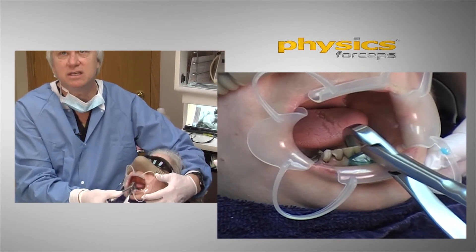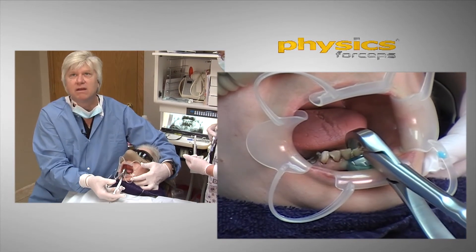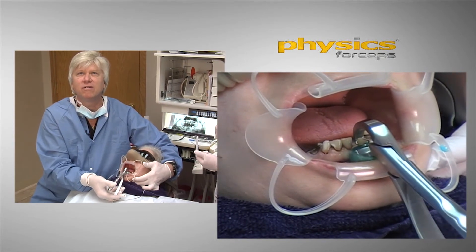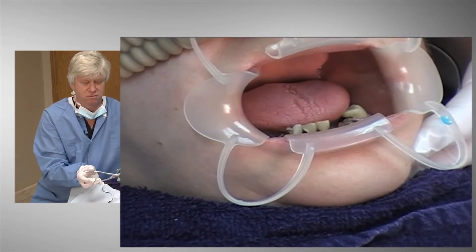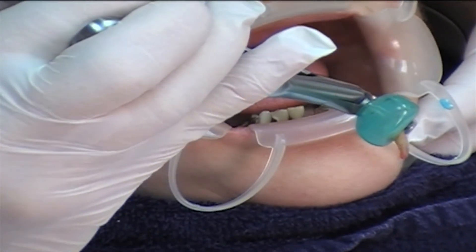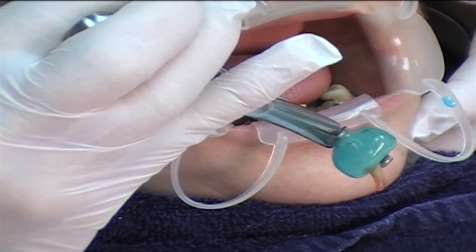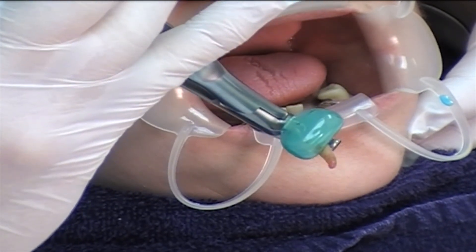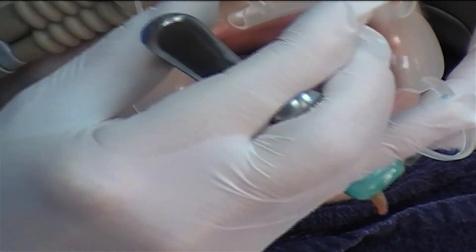Now I felt the tooth — you can see it's starting to move a little bit. It's coming. And that tooth just elevated right out of the socket. Now granted, this is an anterior tooth — but it is a big deal. There's not a lot of tooth structure there in some of these teeth, and you can see there was no physical force at all with my hands or my arms. It really is magic — something I truly appreciate as a tool in the office.